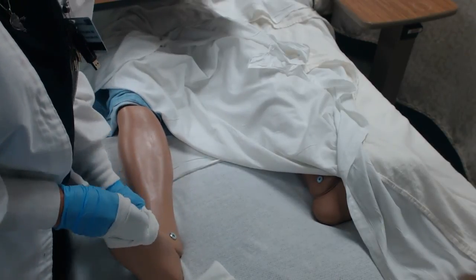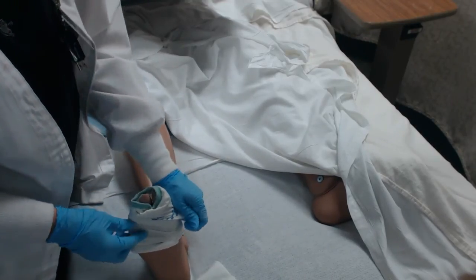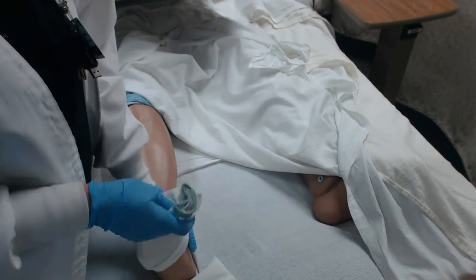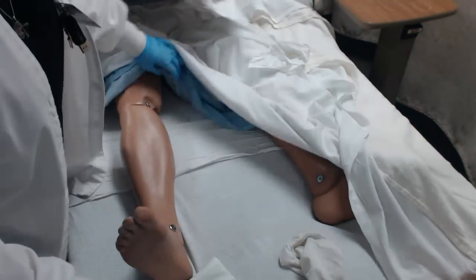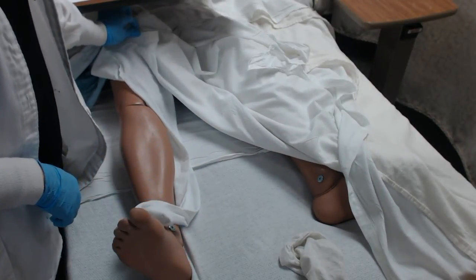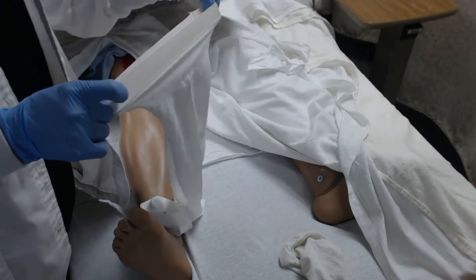So hopefully it will slide on your patient a little bit better. And like I said, this guy is just so hard to get on. They're hard to get on anyway, but these are just a couple tricks that may help you a little bit with that. Okay, so that's knee high, and then as you can see here, this is how long thigh high would be, way up here, right up to the thigh, and it has sort of a little compression around it so that it fits at the top.